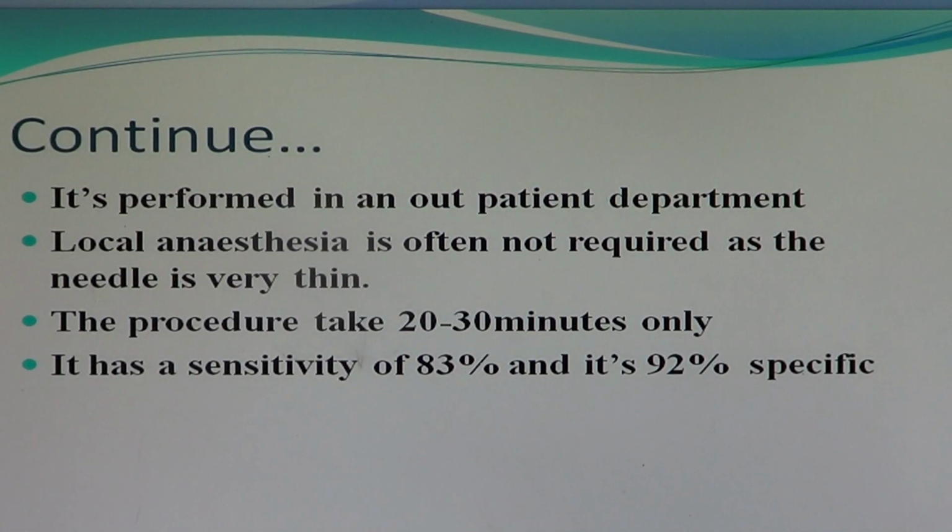It is performed in an outpatient department, so a long hospital stay is not required. Local anesthesia is often not required as the needle is very thin, but it is advisable to use it as it minimizes pain. The procedure takes 20 to 30 minutes only. It has a sensitivity of 83% and it is 92% specific.